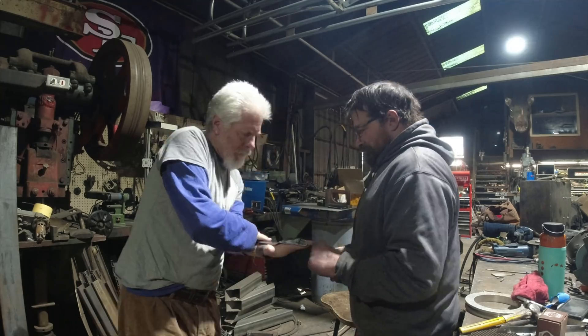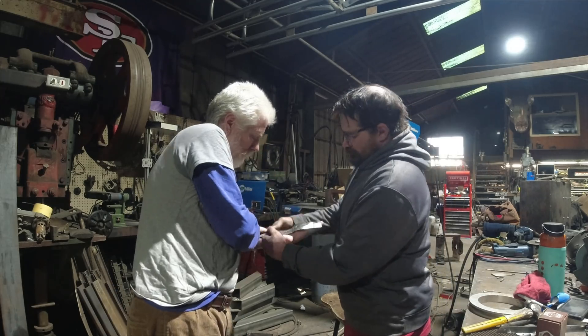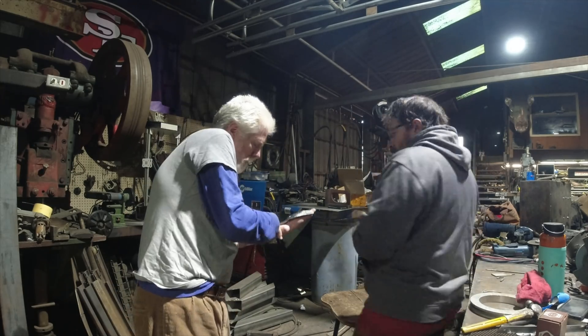What I found that is very difficult about building gadgets for other people is being able to get the fit of the socket just right. Since they're the only ones that can truly know how the socket fits, the participation of the user ends up being incredibly valuable for this type of build.